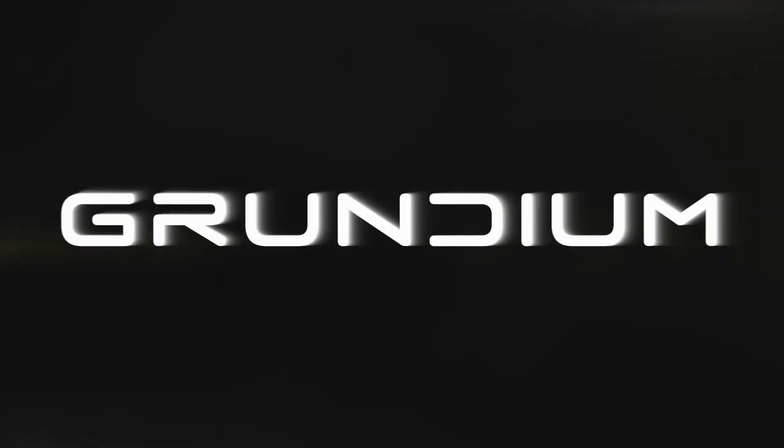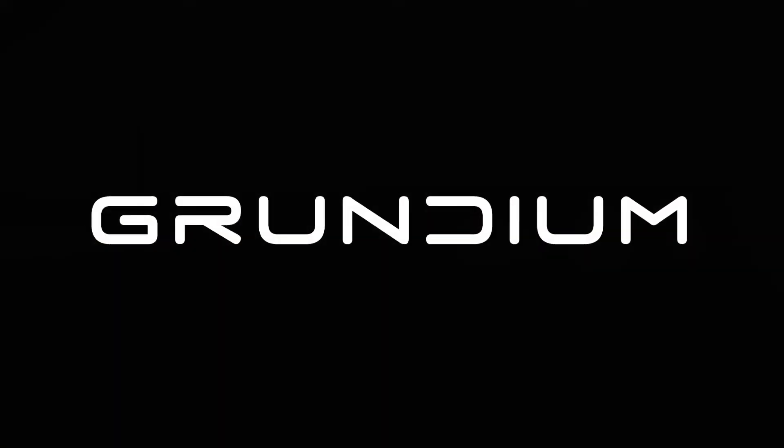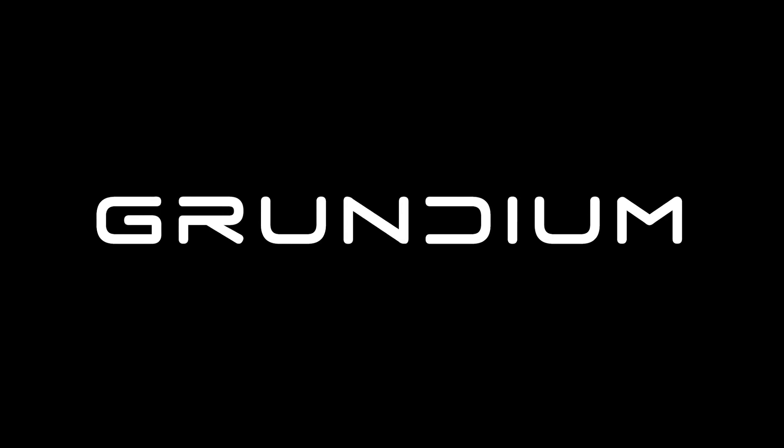Grundium makes the best professional diagnosis available for all life.